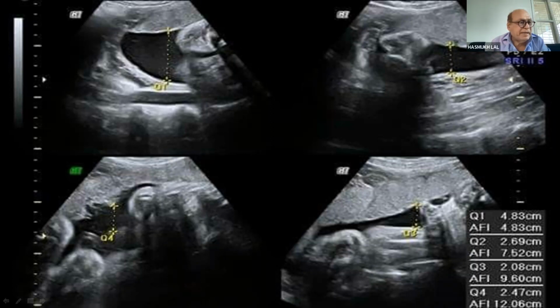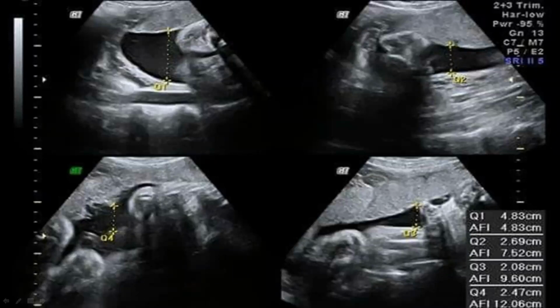Number 5, to scan the number of fetuses in part 1. A is the correct answer. The uterine cavity is viewed with the transducer in transverse orientation from below upwards, from the symphysis pubis towards the fundus, in the right, then mid, and then to the left side. The improvement is from 45% to 58% pre-orientation. Reasonably good.